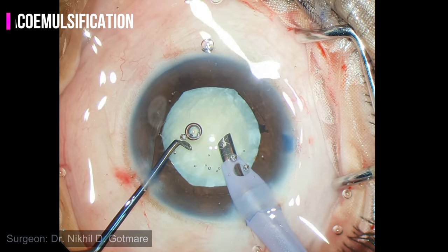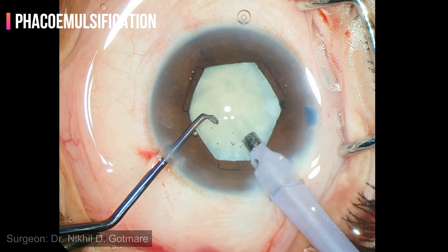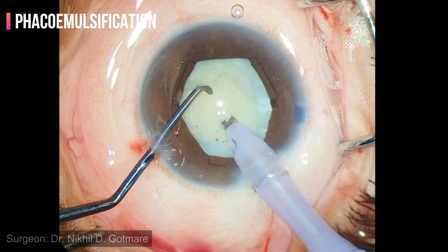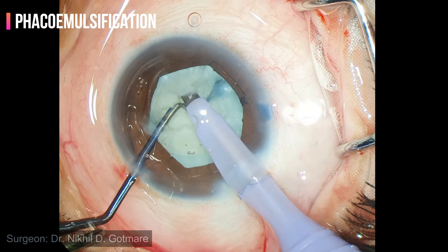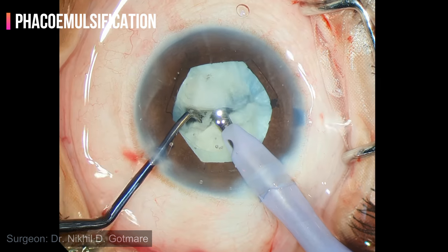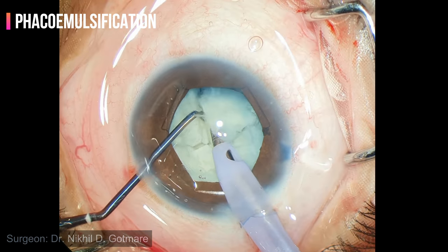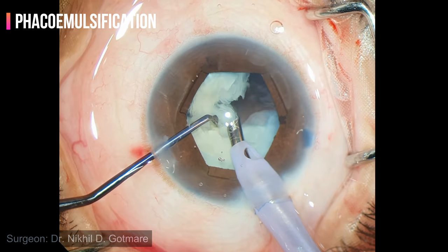Phacoemulsification is begun. Loose cortex is aspirated. I am planning to do a vertical chop in this case — a small trench is made and then the tip is buried into the nucleus. Vacuum is maintained and the chopper is brought towards the tip and then sideways. It is important to do in-the-bag chopping, as the size of the nucleus is larger than that of the ring. Once smaller fragments are obtained, they can be emulsified in the pupillary plane.